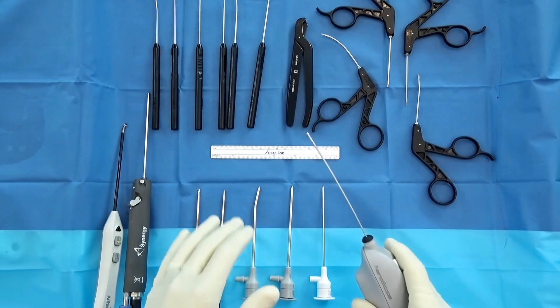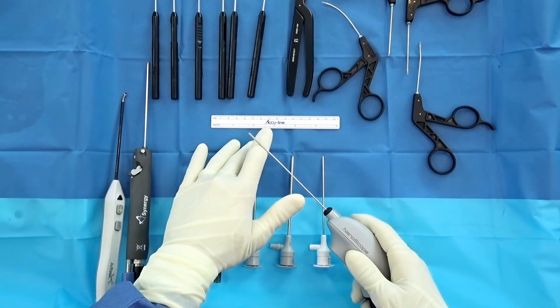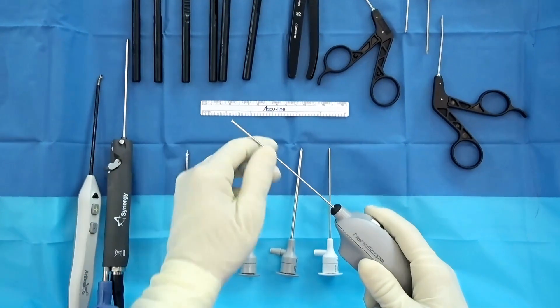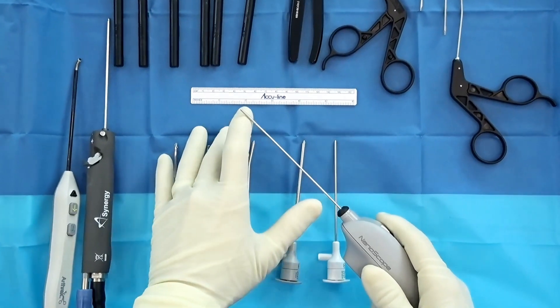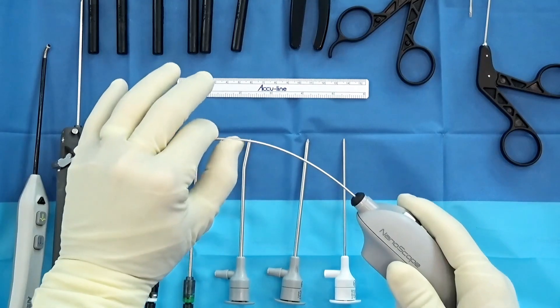Let's go a little bit deeper on the breadth of Nanoscope. Nanoscope itself is a 1.9 millimeter flexible camera, easy to bend and manipulate. As you are bending and manipulating, avoid the chip on the stick — so we avoid a couple of distal millimeters — and the rest is very bendable.